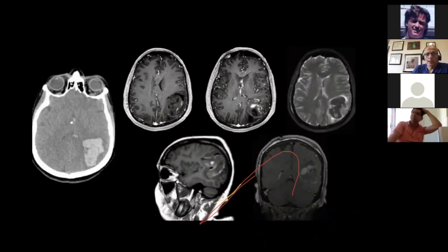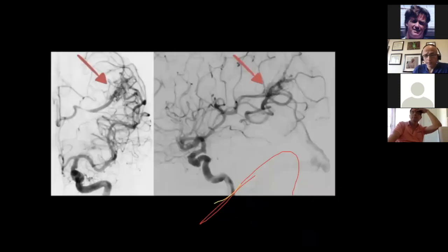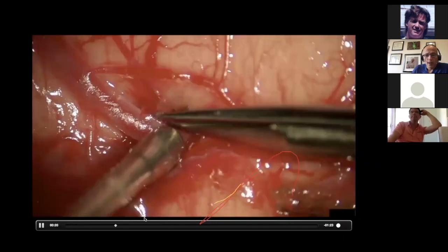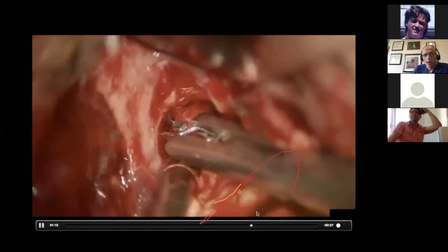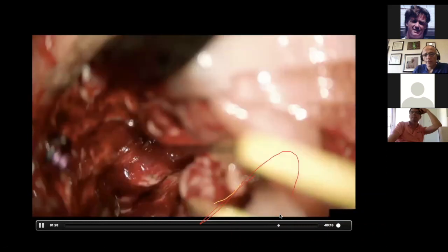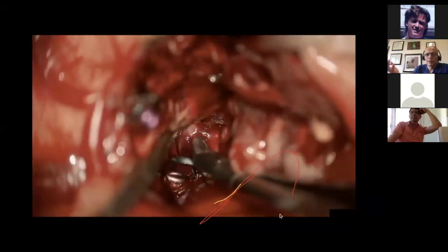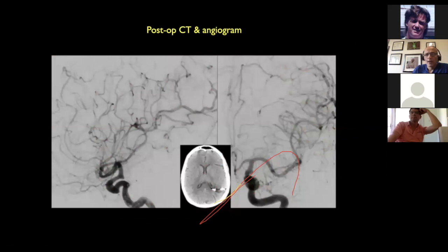And this is another case, came to us from another center emergently, large hematoma, and she was comatose, GCS 6, became GCS 3 en route, and we did a quick angio and took her to surgery and did the same thing: evacuate the hematoma, and then remove the AVM. It's a small nidus, I don't want it to come back, I'm there, I'm evacuating the hematoma, I can remove this, doesn't matter. And she's perfect, mRS score 0 at 1 year. It takes time to improve though, okay?